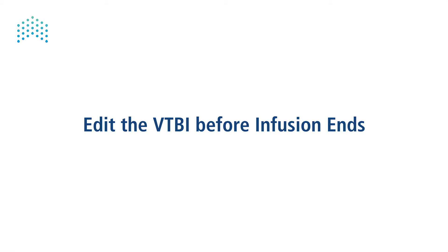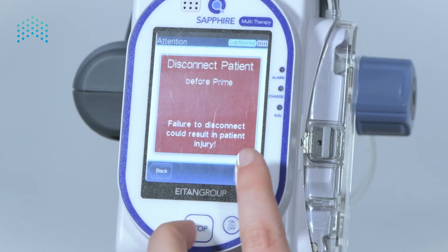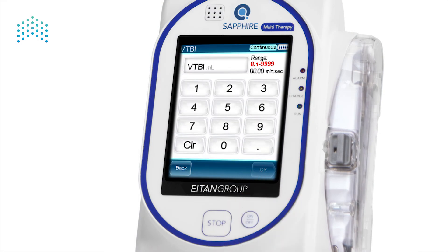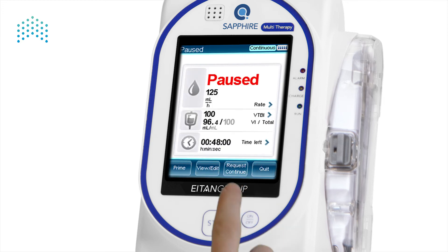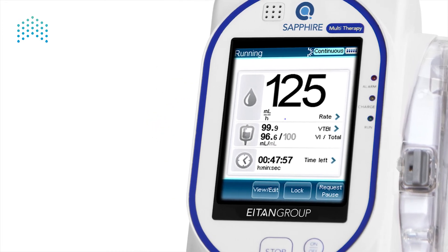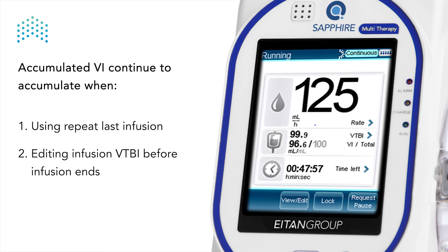Edit the infusion's VTBI: stop the pump. Connect the new medication reservoir. Disconnect the patient and prime as needed. Edit the VTBI on the pump. Enter the volume required according to the clinical order, and press Request Continue and OK on the confirmation screen. Using one of the above options will prevent the accumulated VI from being reset. Thus, the accumulated VI will continue to accumulate as long as the repeat last option or the edit VTBI option are used.